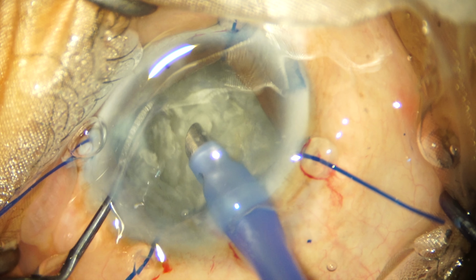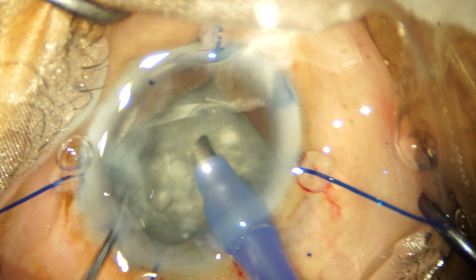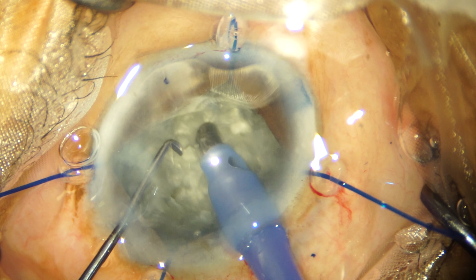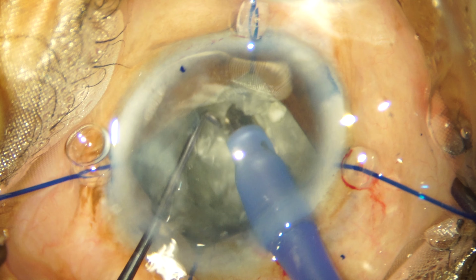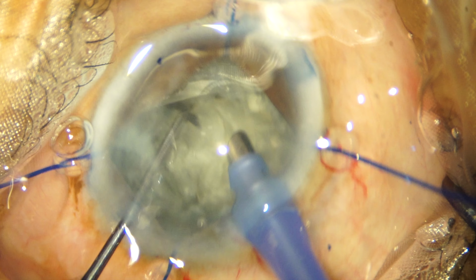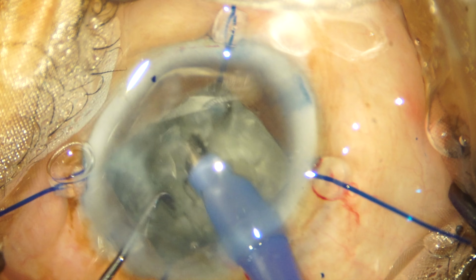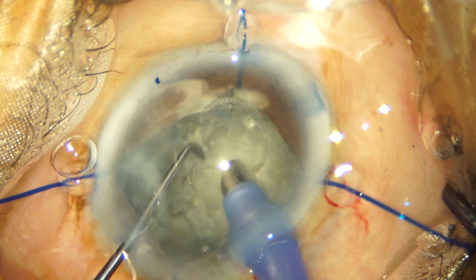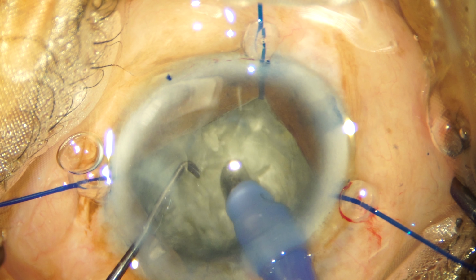Here again I achieved a partial chop. I could not penetrate the posterior plate in this instance. Again I begin rotation and attempt a chop from another place. The posterior nuclear plate is now much more defined, and I decide that since those small fragments of the nucleus are not prolapsing out, I'll try and break the posterior nucleus plate.